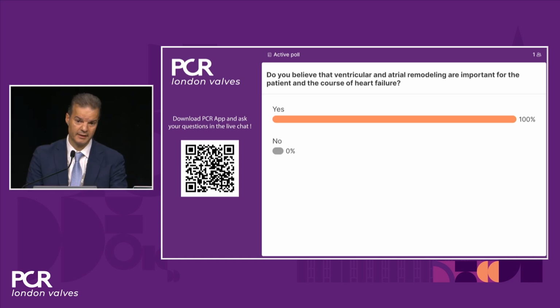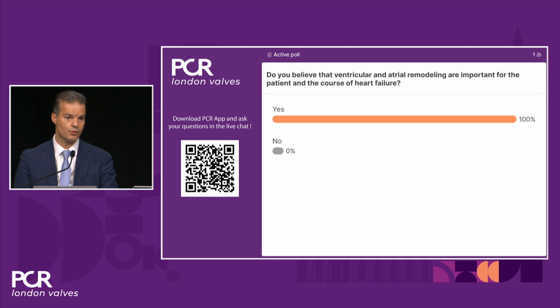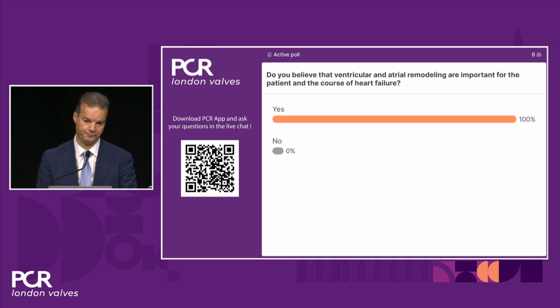Well, we have some data that shows that despite the amazing clinical improvement of this population, we do not see any reverse remodeling of the left ventricle. So the dimensions do not seem to reduce. We don't have any reduction of the volume, both end diastolic or end systolic. We have increased cardiac output because obviously the backward regurgitant volume from the mitral regurgitation is eliminated, but we do not see the signs of remodeling. So this is an unmet clinical need.